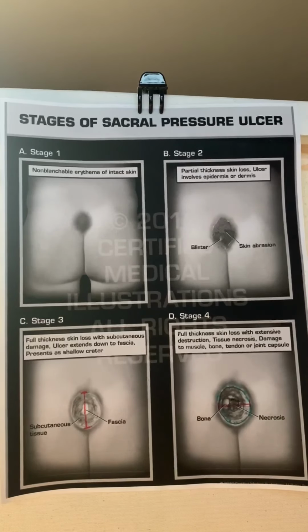Studies also show that wound sizes are overestimated by almost 50%. So a standard measurement guide is definitely needed, so there's not a variable in wound measurement, and it's constant from nurse to nurse.